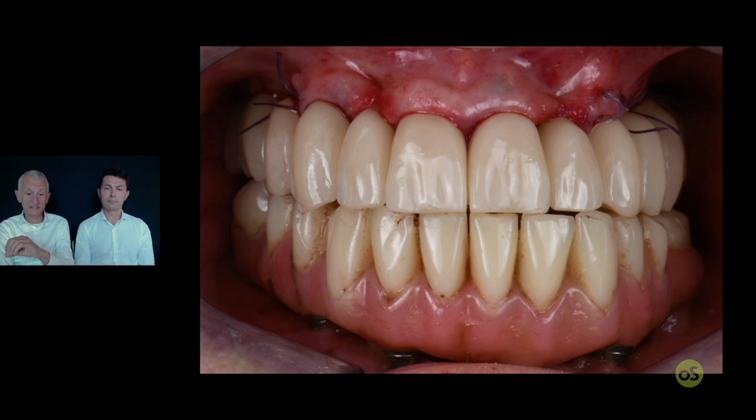And because the vertical dimension is smaller here, we decided to use hybrid ceramic so that we can still have very good durability even if the dimension and the material is smaller compared to the lower. Okay, so this is a way that is very, very helpful for the dentist because it can provide the patient in one appointment with already a final restoration when there is the indication and the condition necessary to address this.